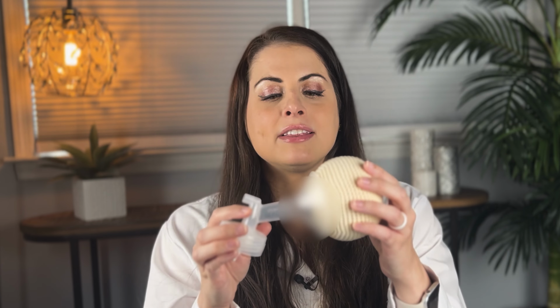Another tip I have for you goes along with that air tightness. Airtight seal is key. Once you position the flange correctly, you're going to want to gently press it against your breast. You're going to want to make sure that it's held there nice and tight so there's no air leakage around it. Ensure that there's no gaps or air leaks between the flange and your skin. An airtight seal guarantees optimal suction, which again leads to better milk flow.